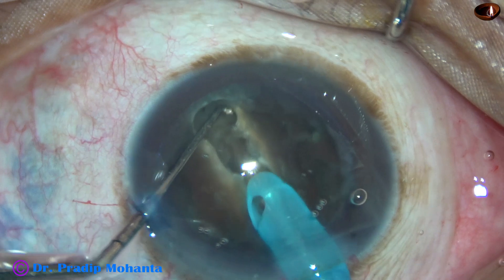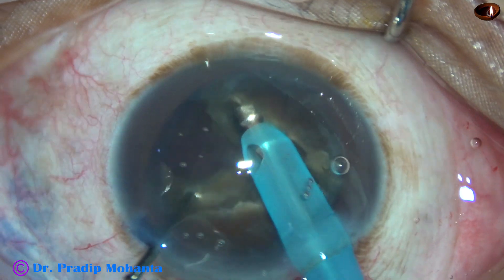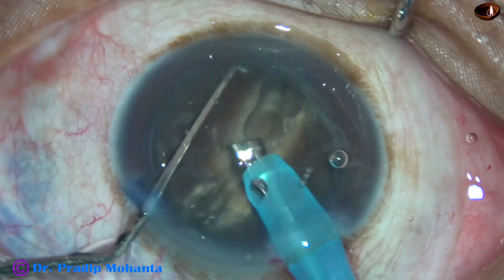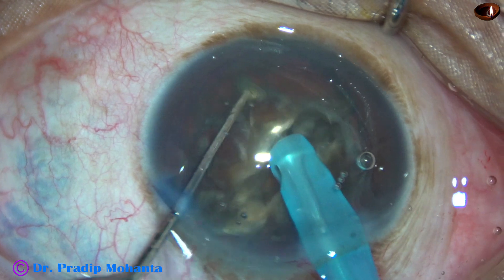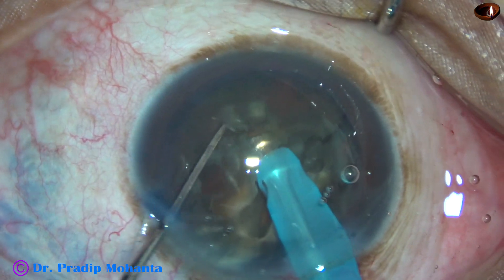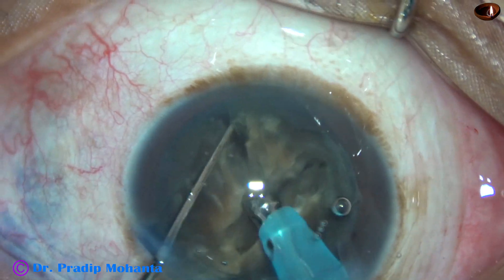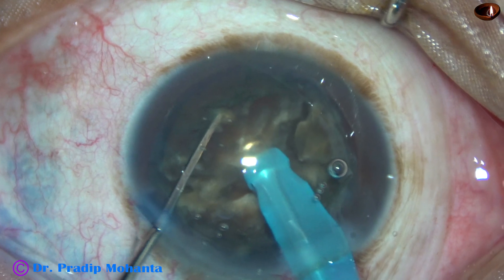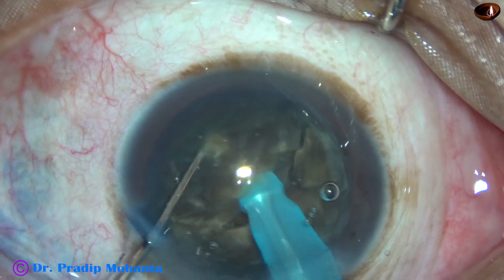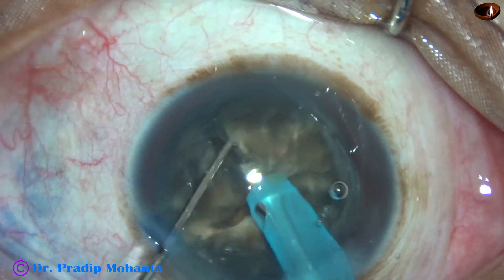I do one or two sculpts, go to a deeper plane, hold one half of the hemi-nucleus, and separate the two hemi-nuclei completely. In this case, I am going to divide the nucleus into 6 pieces — each hemi-nucleus is being divided into 3 pieces.